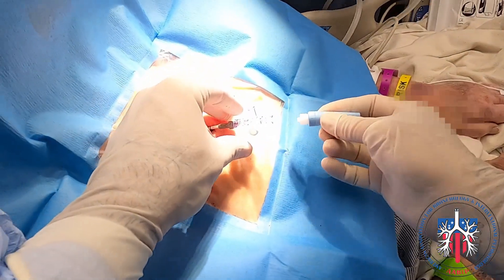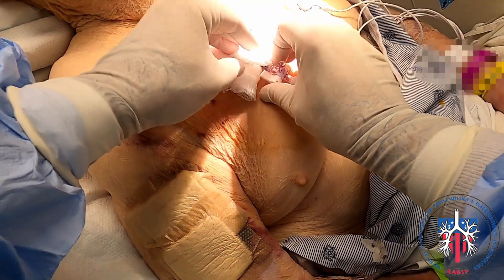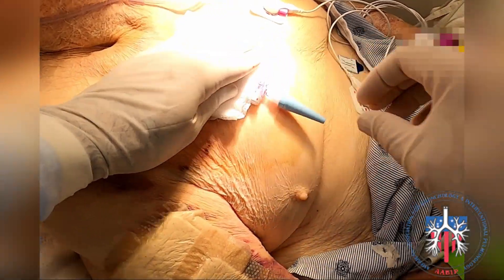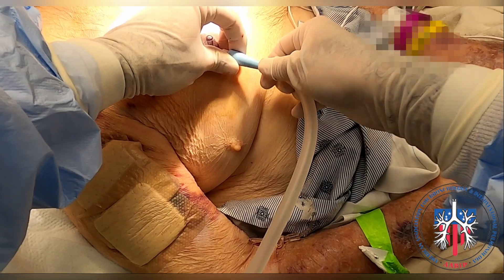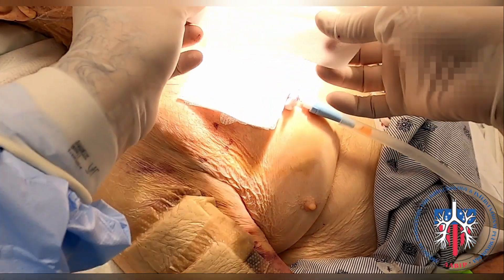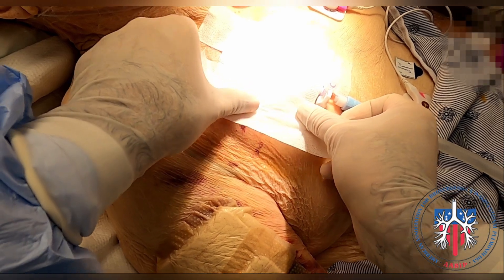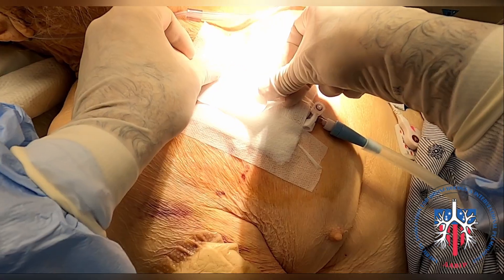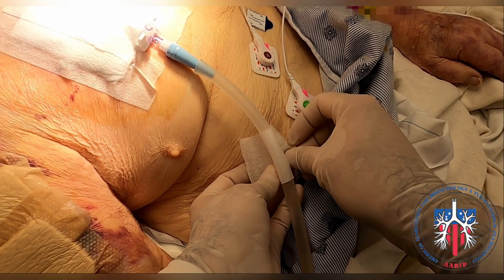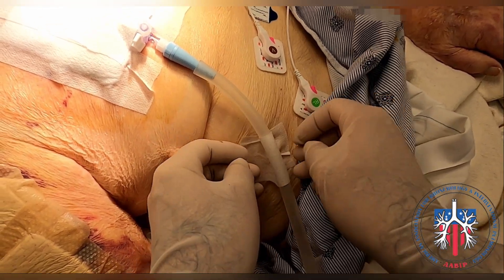We place an adapter to connect to the drainage system and the drape is removed. The entry site is then covered with gauze, making sure that the three-way stopcock is still accessible. The chest tube is connected to the drainage system and the chest tube entry site is dressed with a one-way valve. We also attach the drainage tube to the patient's body to prevent sudden movements and dislodgement.